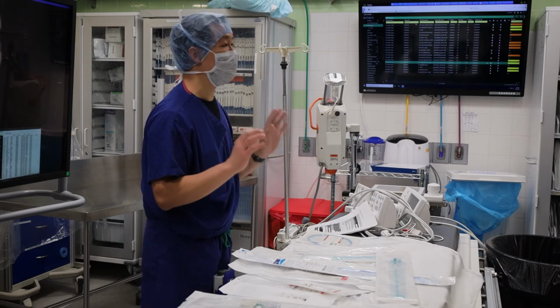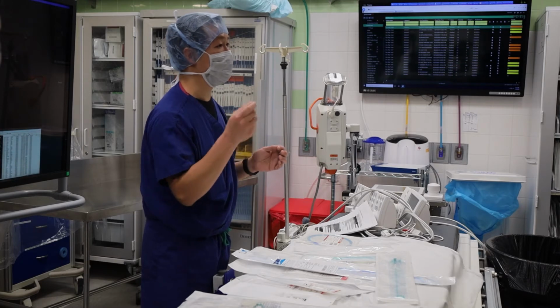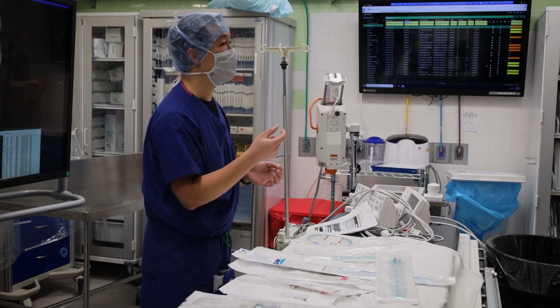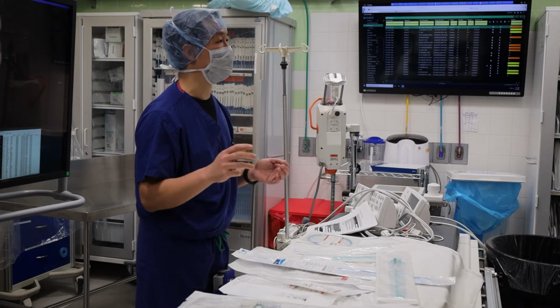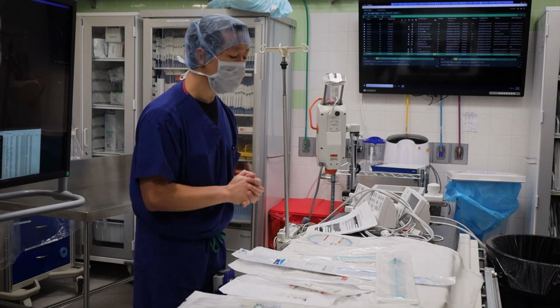Or 1-way, 3-ways, a lot of times the connector is really small. In fact, even if you look at drainage bags, the little luer, the lumen of it is actually really small. So if you have really thick stuff coming out, you've got to think about those things, otherwise the flow might not come out.